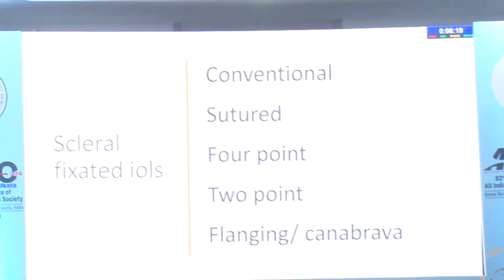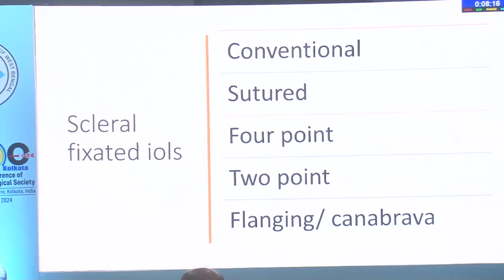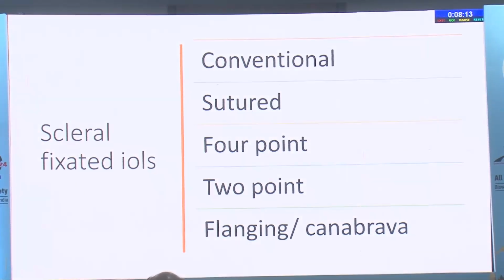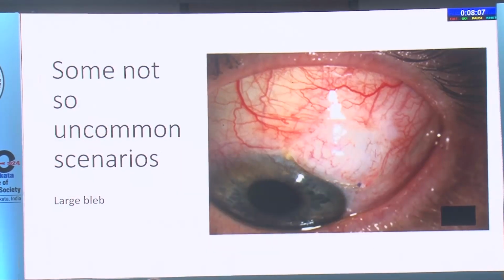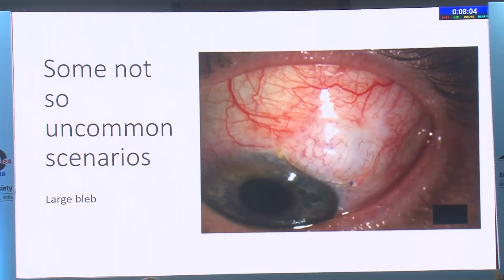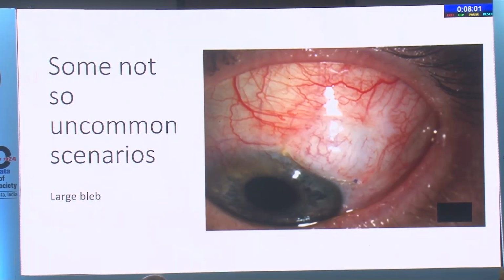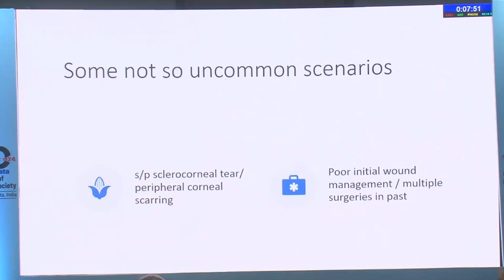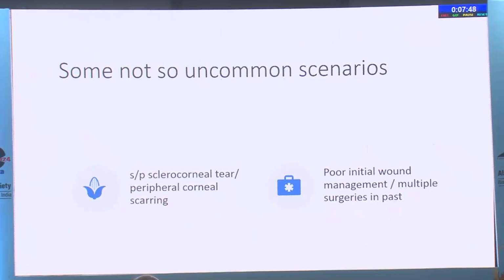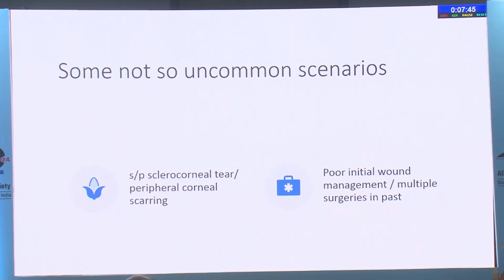Yes. So conventional sutured 4-point fixation has been discussed earlier. Flanging technique and Canna-Brava technique are some of the options available. What is the commonality in all these kinds of SFILs? That they need a tunnel, a sclerocorneal tunnel. Those are non-foldable lenses. So those are some not so uncommon scenarios. This patient has a large bleb, you can't do a tunnel. What will you do? The patient might be having ciliary staphyloma or thin sclera, again you can't make a tunnel. Then he might be having a sclerocorneal tear or a peripheral corneal scarring, or poor initial wound management, or the fellow or the PG who is doing surgery must have done multiple suturing and scarred that area.